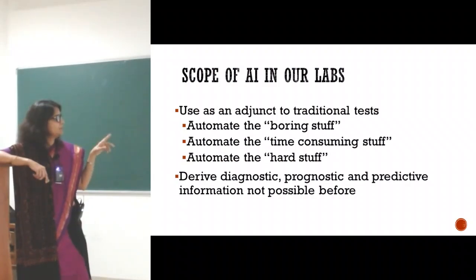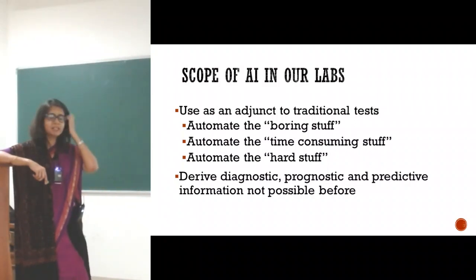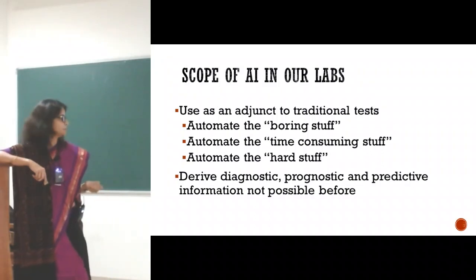And there are some difficult things to do like scoring, like mitosis counting, which are very tedious. So if we can at least delegate some of our work to the machines, like the radiologists have and like in many other situations people have, that would make a big difference, and that is where the science is totally moving towards.